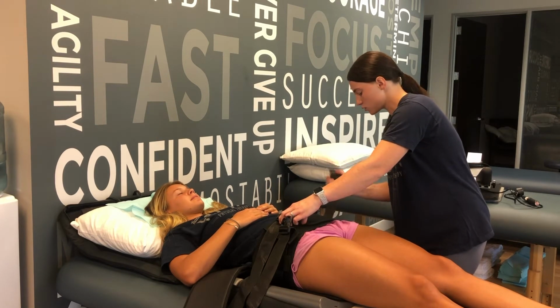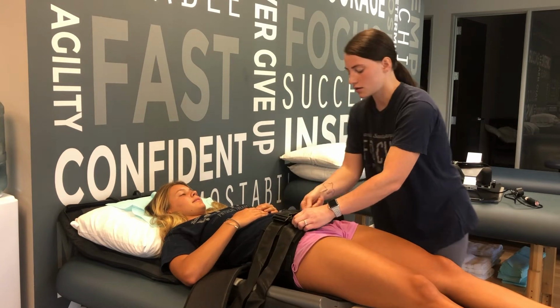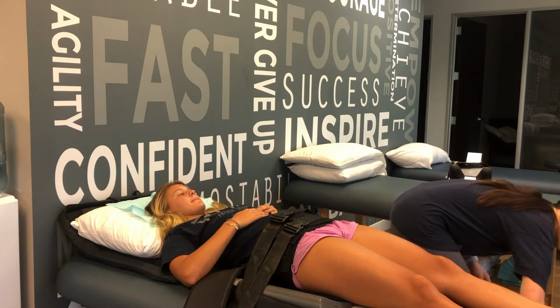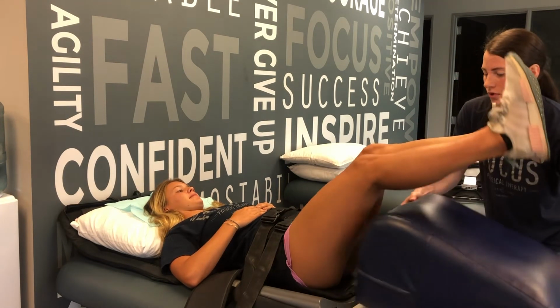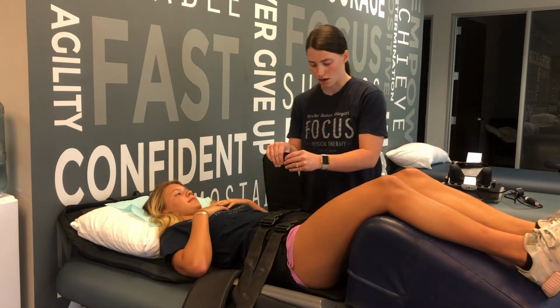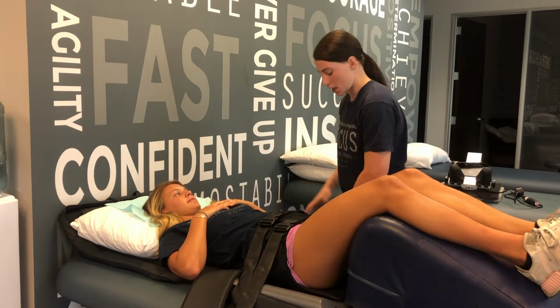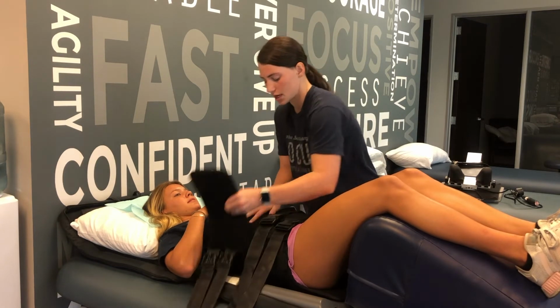going to get these buckles, strap it in, and then also, usually before I do that, I have their feet up on a bolster. So we'll raise your feet up, and right there, just so that their back is comfortable. And then with this one, I'm gonna have this going more around her rib cage, kind of above her pelvis. So we'll do the same thing.